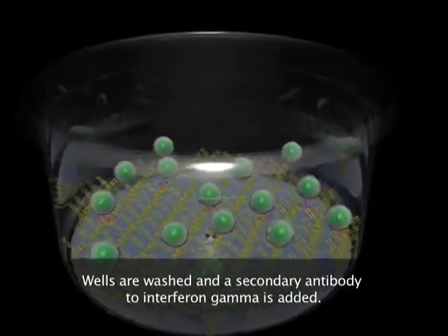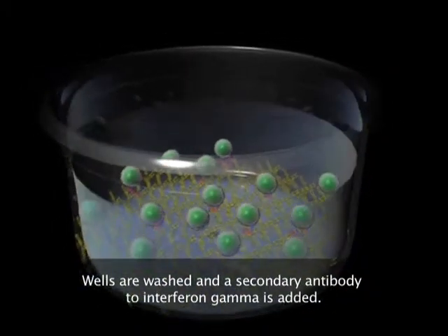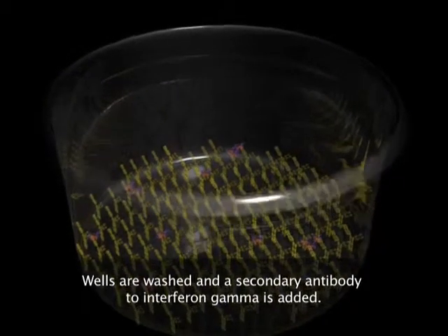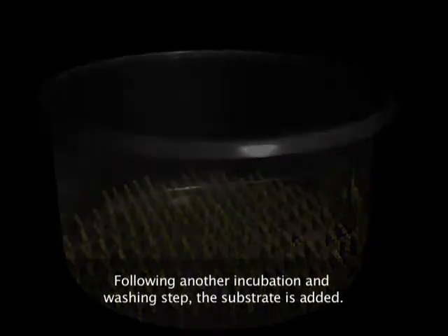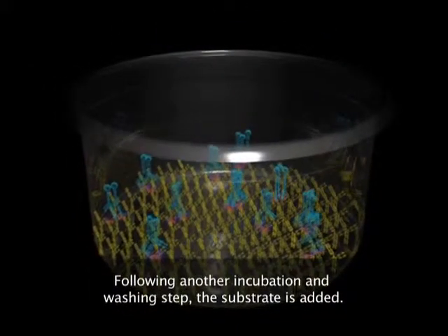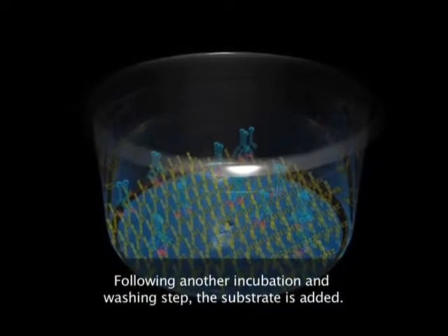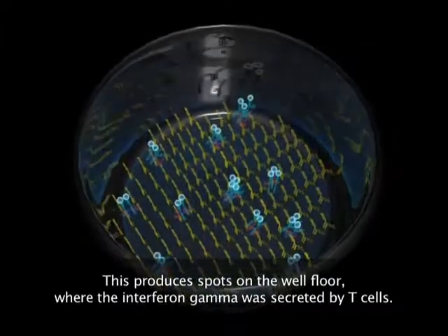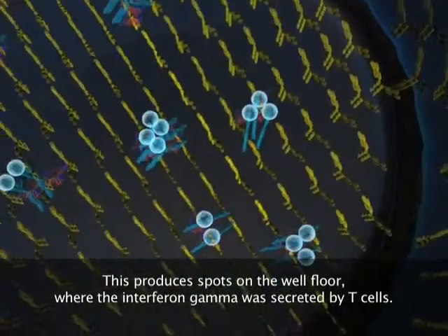Wells are washed, and a secondary antibody to interferon gamma is added. Following another incubation and washing step, the substrate is added. This produces spots on the well floor where the interferon gamma was secreted by T cells.